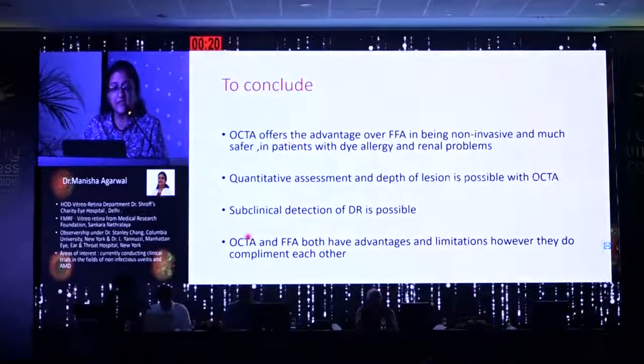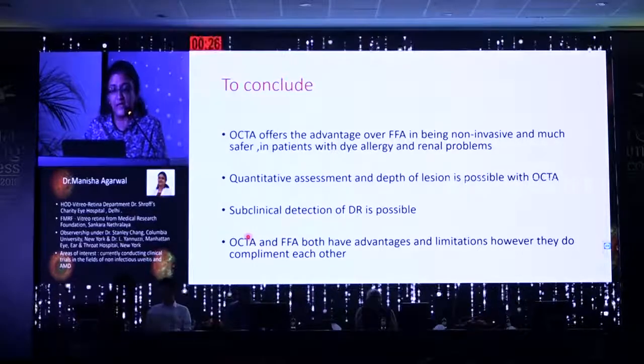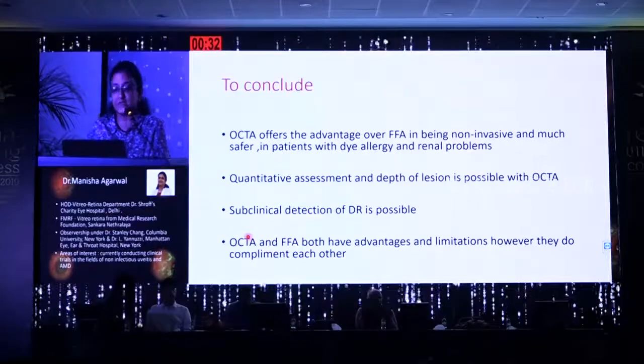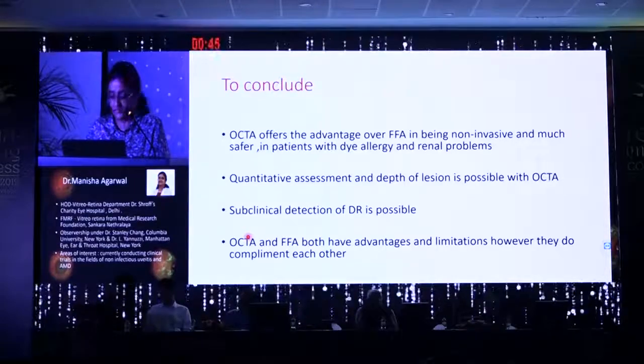So I would just conclude by saying that OCTA offers the advantage over FFA in being non-invasive, much safer in patients with dye allergies and renal problems. A quantitative assessment and depth of lesions is far more possible to assess with OCTA in comparison to an FFA. A subclinical detection of DR is possible. However, OCTA and FFA both do have their own advantages and limitations, but they do complement each other. Thank you so much.